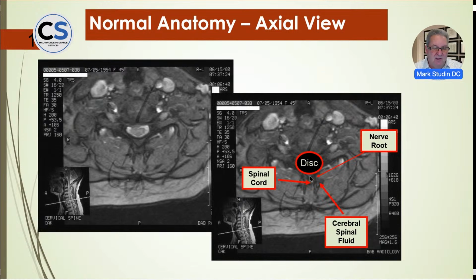But bone scans are really important when you're looking for fracture, tumors, degeneration. But MRI is best for visualizing spine. Not X-ray, not CAT scan, MRI. And in our world, we're never going to use contrast. Let me rephrase it. We're rarely going to use contrast. Contrast is for post-surgical MRIs. Contrast is when you're defining tumors and other issues.